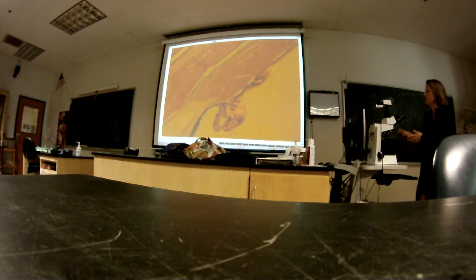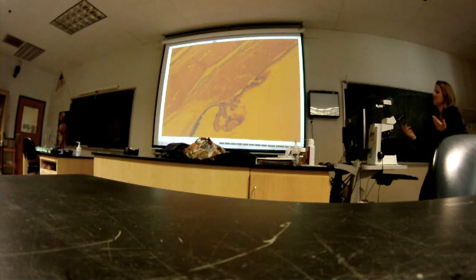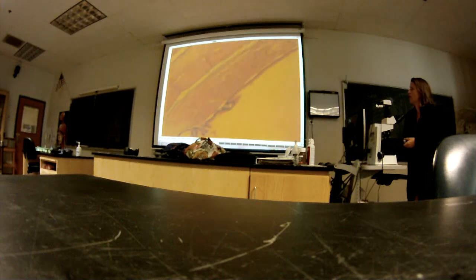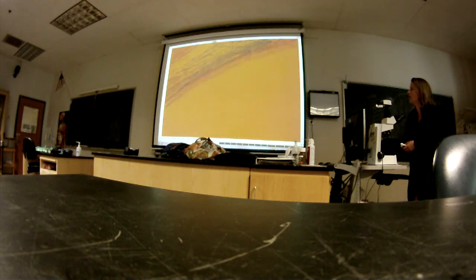Okay, so then what is this entire structure here? Ciliary body. That's the ciliary body. Good. And how about just these? Ciliary processes. So ciliary processes here, ciliary body includes the processes. I know this is the ciliary muscle in there as well. Okay, so you follow back up. You see it changing over to which main layer? Vascular. That's the vascular tunic, but more specifically, the choroid, yeah.